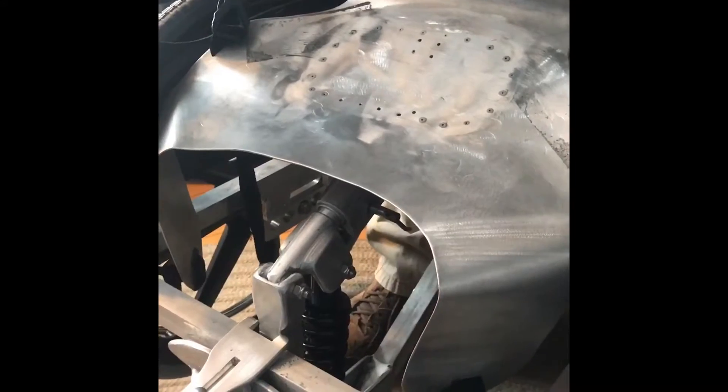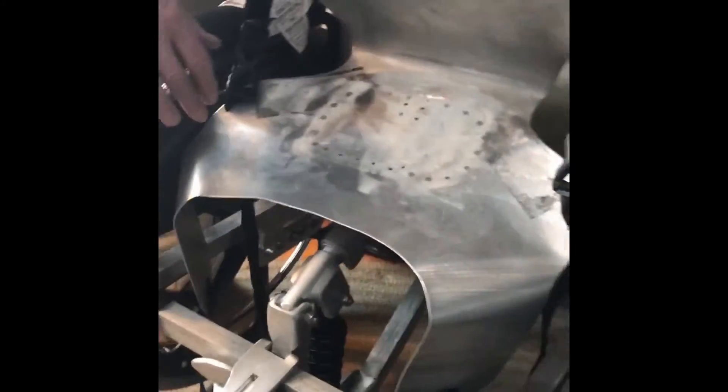That was easy. I need to get the little red knob down in here. There we go.